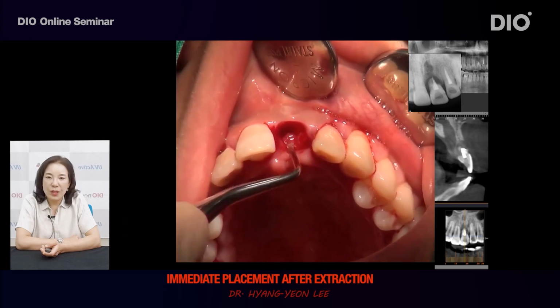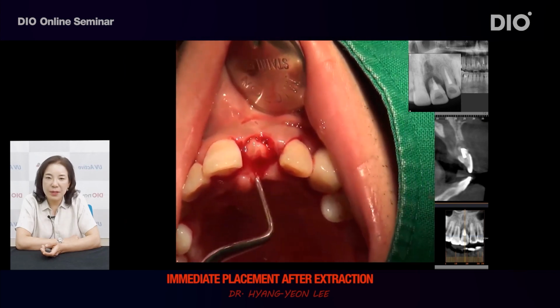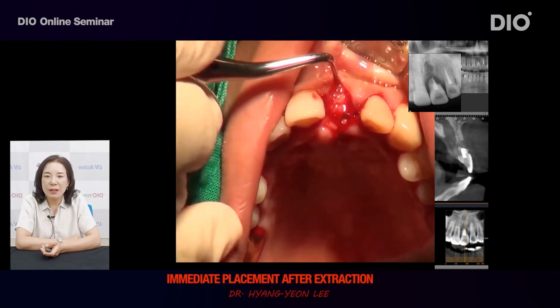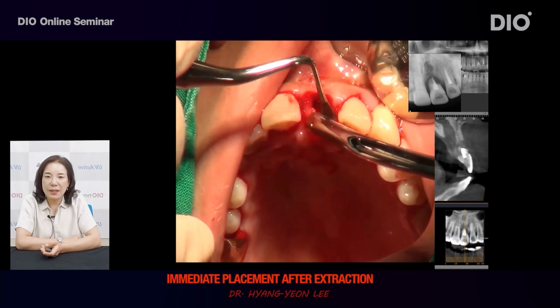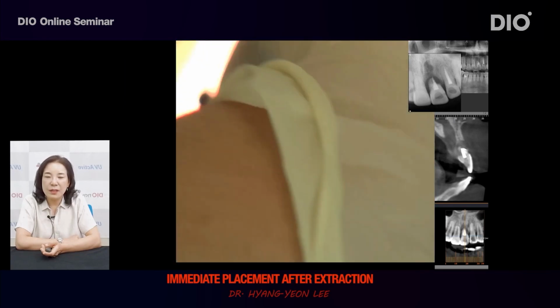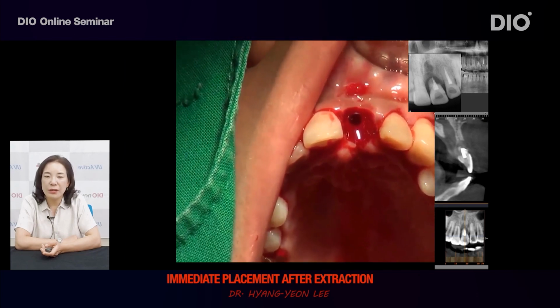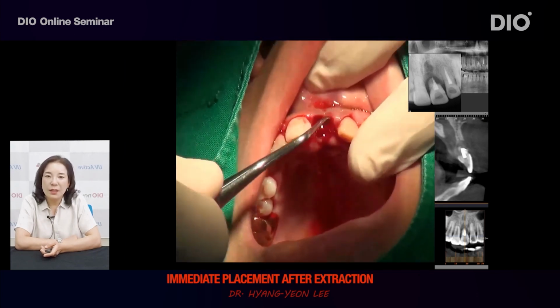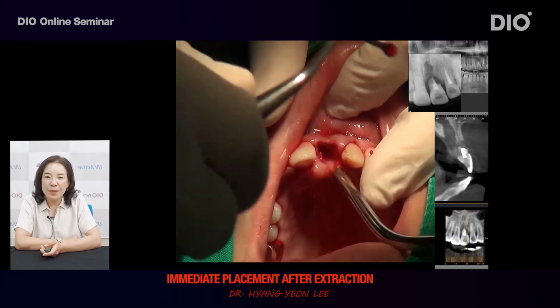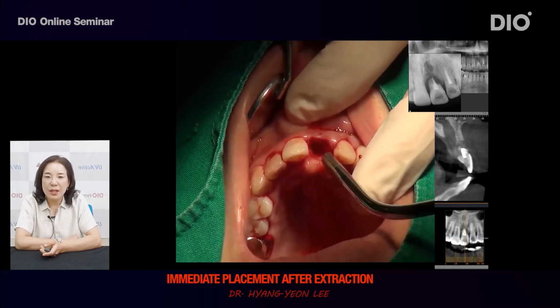After the tooth extraction, inflammation lumps are being scraped off. Scraping alone may not be enough to remove all the inflammation lumps. In such a case, it is possible to remove inflammation with a Kelly. Since they are difficult to remove, rip them off with a Kelly and thoroughly use a curette on the inflammation tissues stuck on the bottom inside of the bone tooth extraction socket.